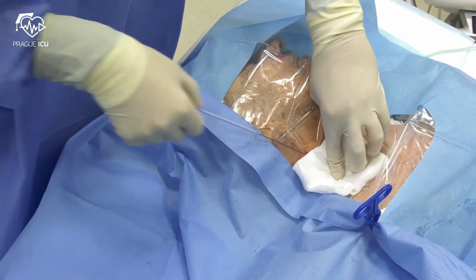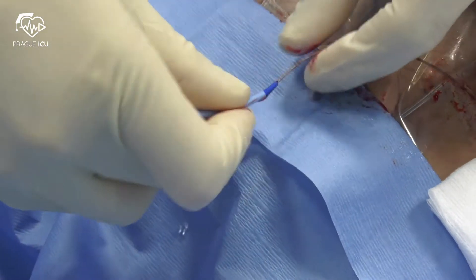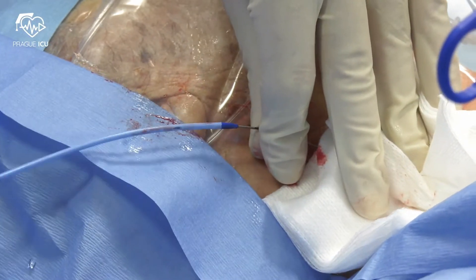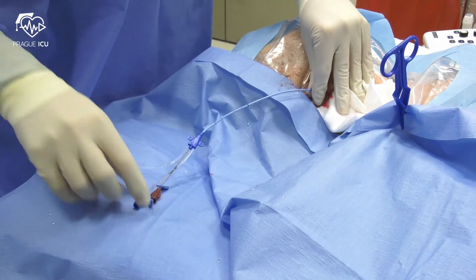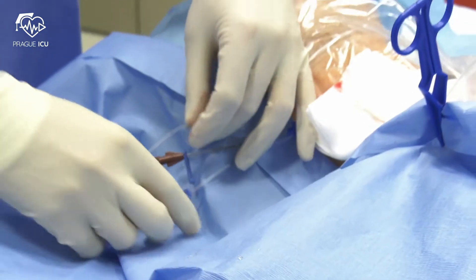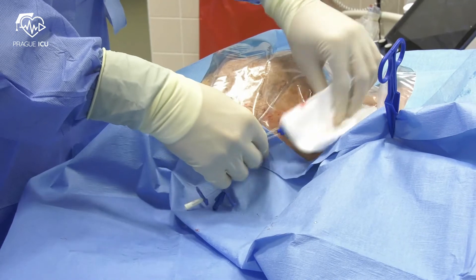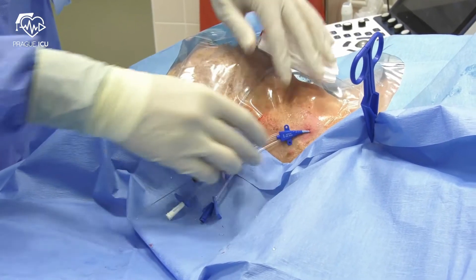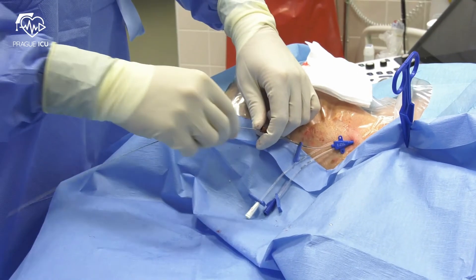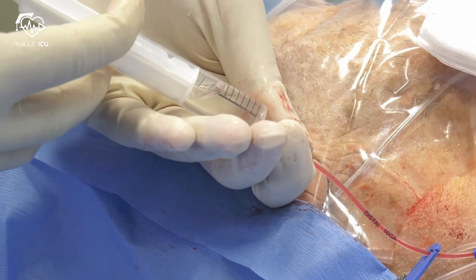Remove the dilator and anticipate bleeding. Apply gauze pad to minimize the blood loss. Then advance the catheter. Do not advance the line until you have hold of the end of the wire. Remove the wire and check the blood return in all ports. Aspirate and flush all lumens, then reclamp and apply lumen caps.